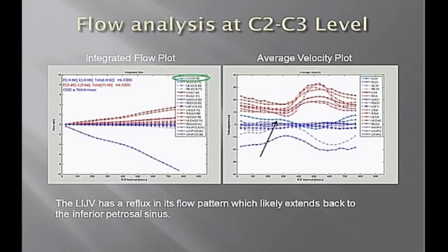If a radiologist had looked at this picture, what could he have said is abnormal? Nothing, except that structural abnormality. So the flow gives you the functional information. The flow is probably one of the most critical pieces of information, not only to tell you that there's something wrong and feed into the data that Robert showed and Clive showed, but also for you as an interventionalist to decide, should you really treat this person or not? And I'll give you another example of this in a moment.